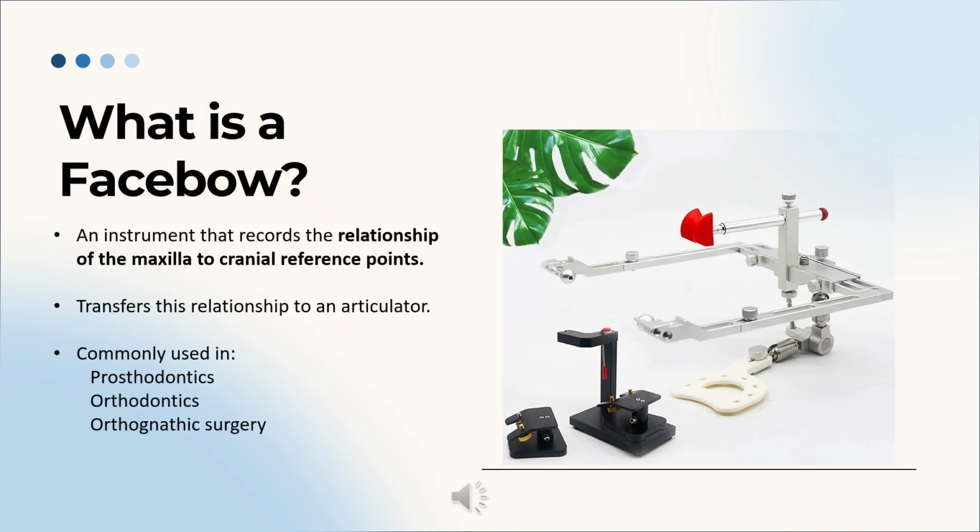So a face bow is basically an instrument that's used in various departments, such as prosthodontics and orthodontics, and particularly orthognathic surgery, in order to accurately record the orientation of the maxilla so that it can be replicated on the articulator.